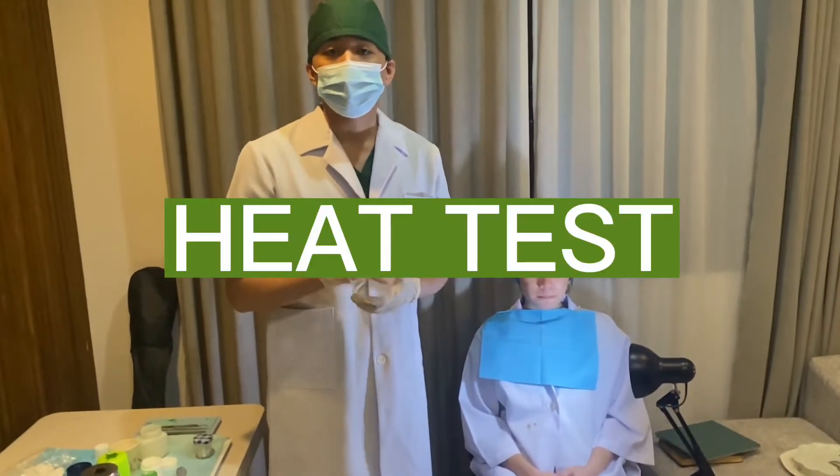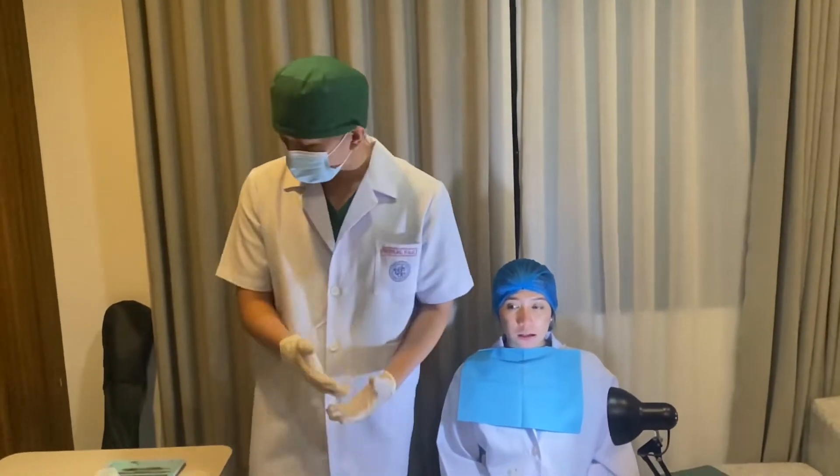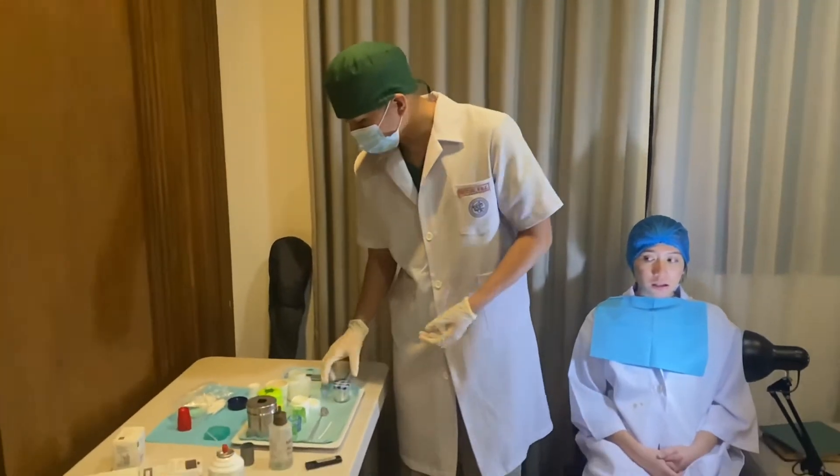I will now be doing the second test, which is the heat test. I will clean, dry, and isolate the teeth, but just in case, I will dry it again using a cotton ball.